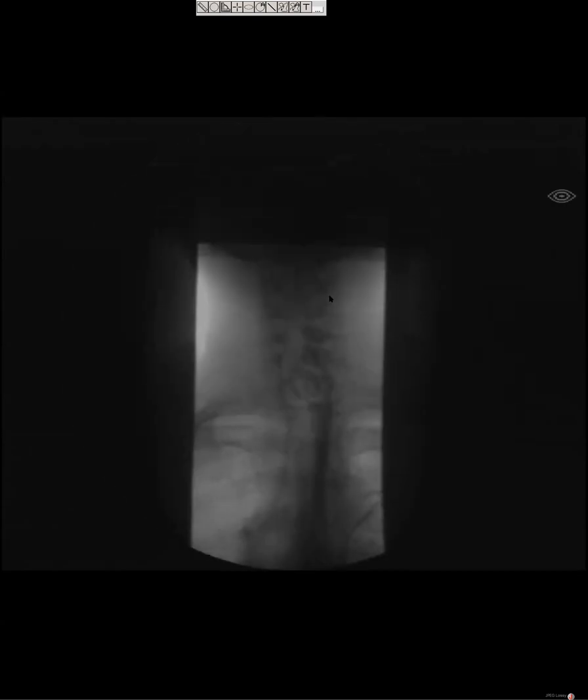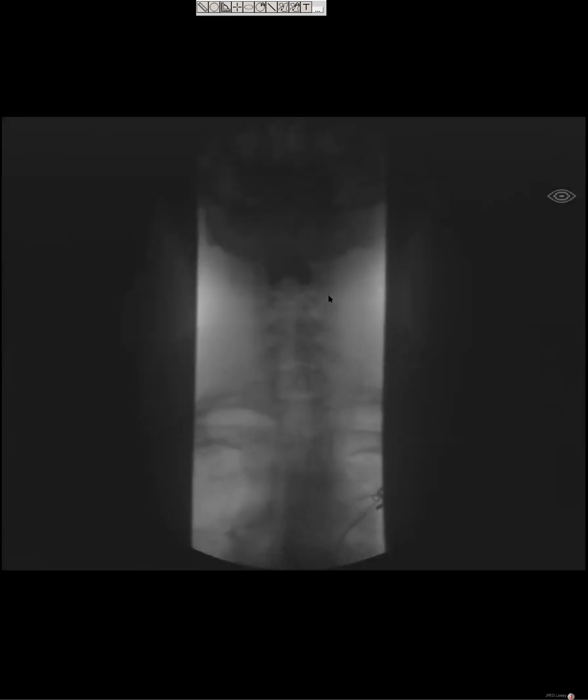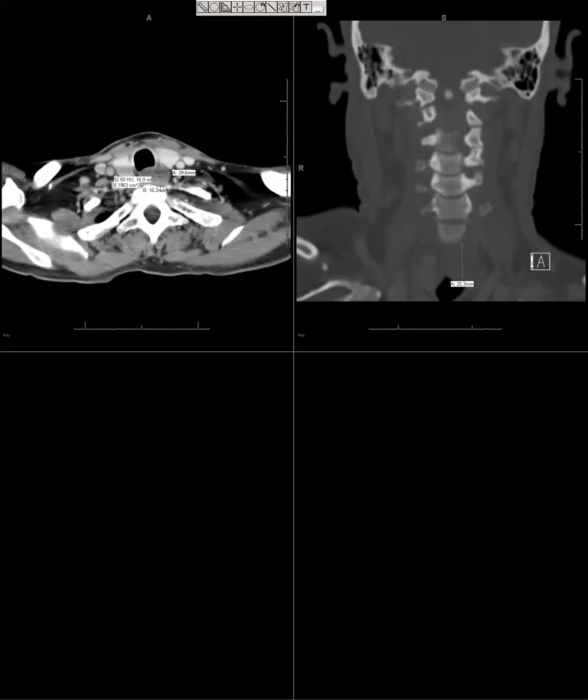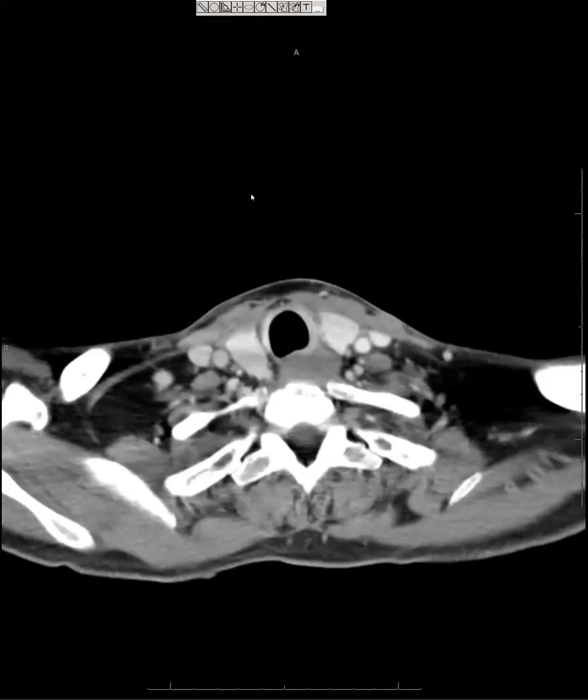And you almost with the gas can see the outline of something there. Is it histiocytosis? No. I don't know what it is. And then on the frontal, maybe not this swallow, but the next one with more volume, I think you can sort of see that. Do you have an MRI? No, I have a CT. Yes, CT. This is bone. Let's go to soft tissue. And so there it is on CT.